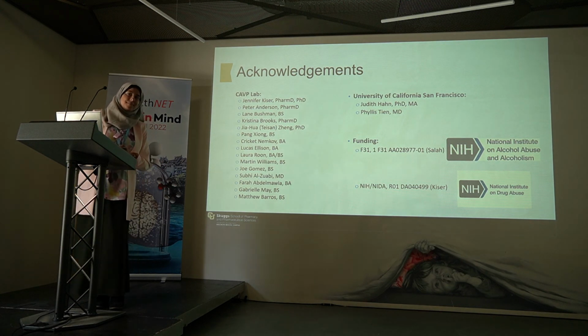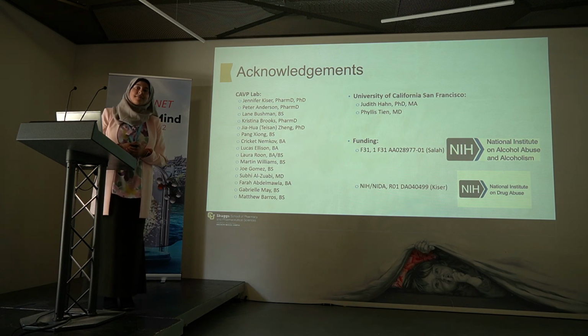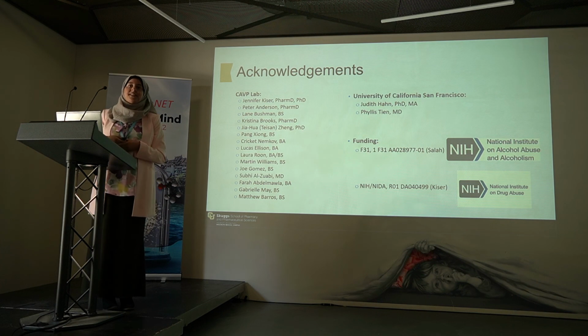I have a question about that ISR study, so using the same spot or same card? How do you consider the sample in the ISR? So it's not the same spot because when we extract with the spot, we then discard it later. So it's samples from the same card. So it's spots that were taken at the same time, but we're just using a separate one. Thank you.